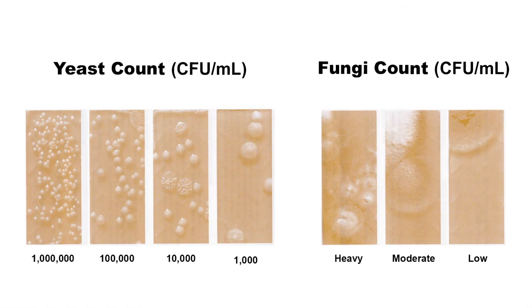The brown side will detect the presence of yeast and/or fungi. Growth on this side may consist of pure yeast or fungi or a mixture of both. Growth and type should be recorded when first seen, but incubation should be continued for 4 to 5 days to obtain good evaluation of possible fungal contamination.